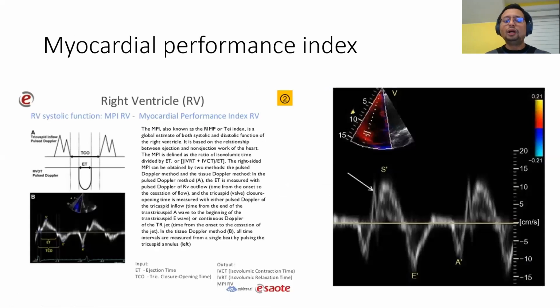All right. Now, what about myocardial performance index? Okay, listen carefully. There are 2 ways. One is by using tissue Doppler. If you use tissue Doppler, we only have to measure in 1 cycle. Use the apical 4-chamber view here, and you put your tissue Doppler there. Make sure your sample volume for tissue Doppler is at least 3 to 5 millimeters. Then you can get this kind of tracing here.